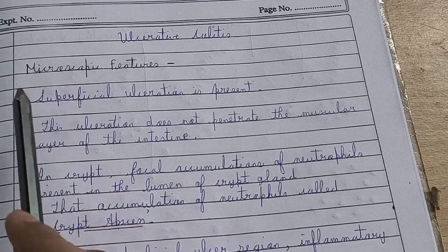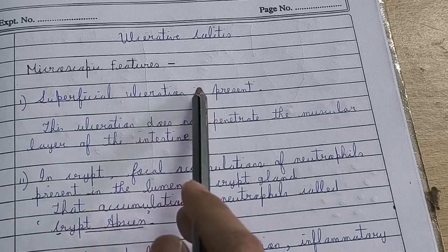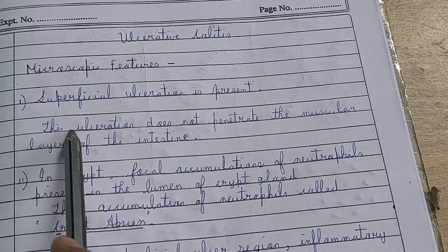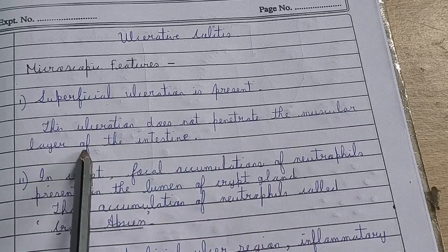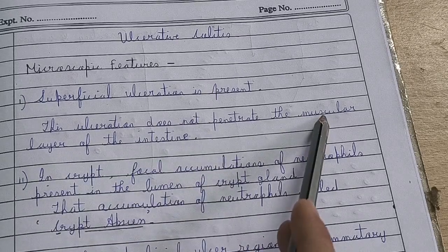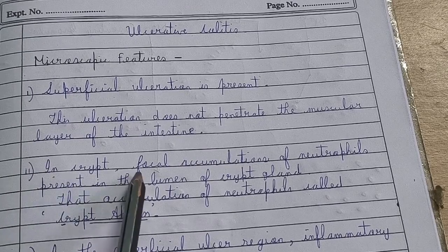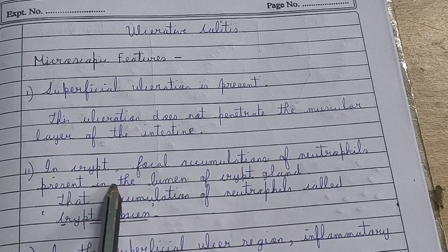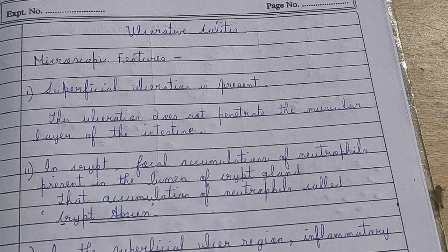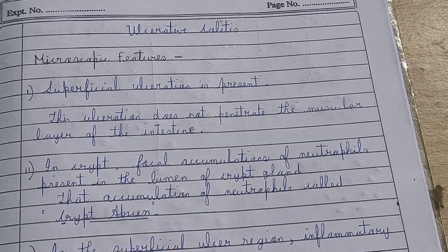So the microscopic features. First, superficial ulceration is present. Why? Because this ulceration does not penetrate the muscular layer of the intestine, or simply the muscularis mucosa, you can also say. Second, in the crypts there is focal accumulation of neutrophils present in the lumen of the crypt gland, and that accumulation of neutrophils is called a crypt abscess.